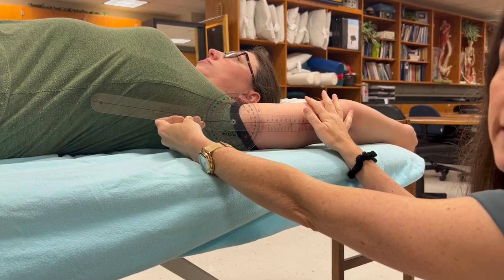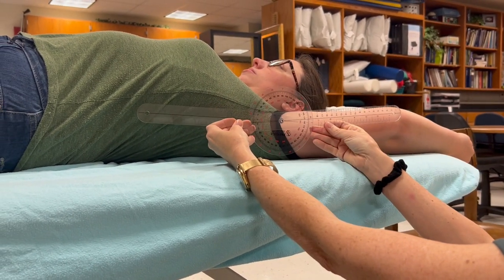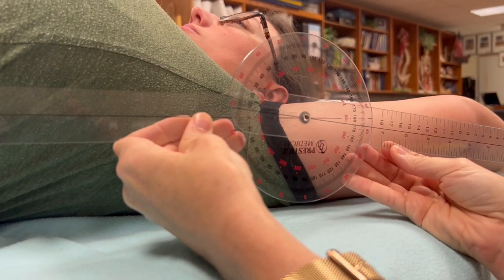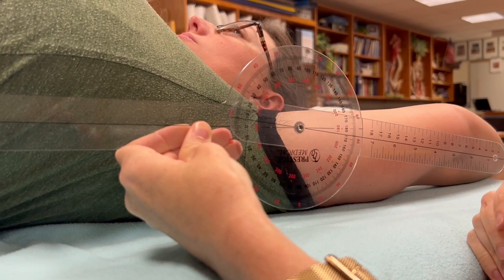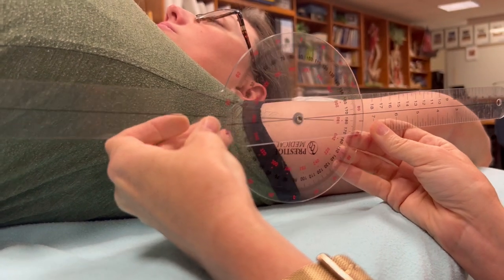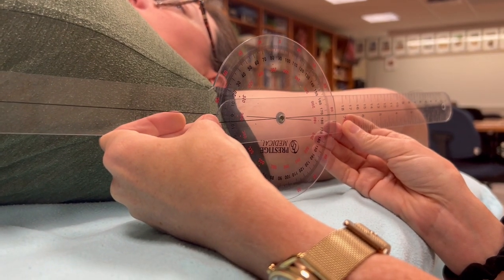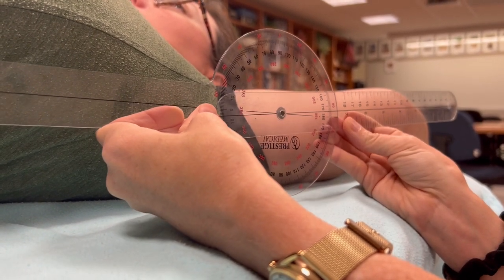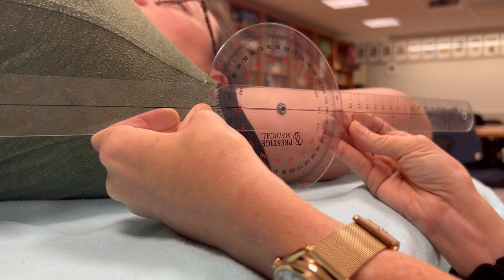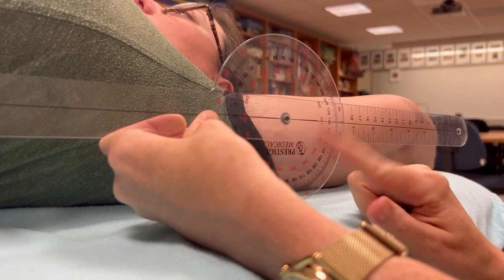It is really important when measuring shoulder flexion to realize that anything on one side is going to be less than 180 - hypomobile - and anything on the other side is hypermobile, if we're measuring the left shoulder. You've got to become really familiar with your goniometer, because if measuring shoulder flexion you read 179 and your proctor reads 181, those two degrees are significantly different - it means you're not understanding which direction you're reading the goniometer from.